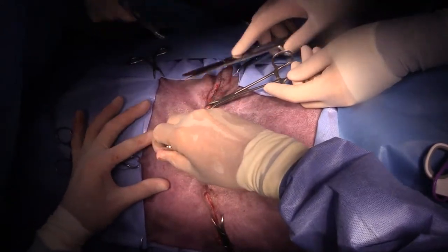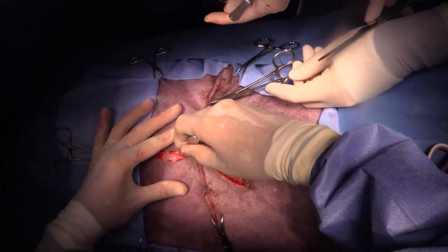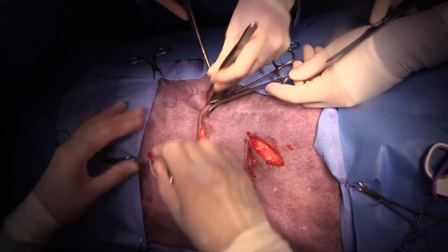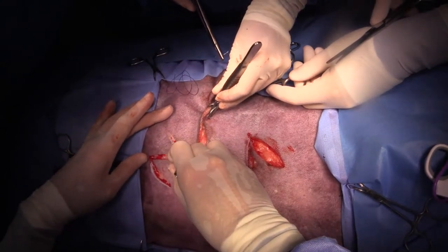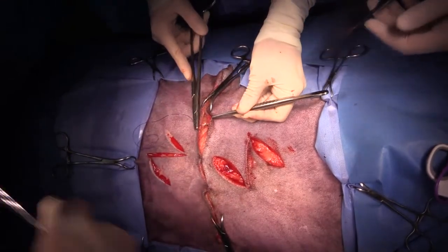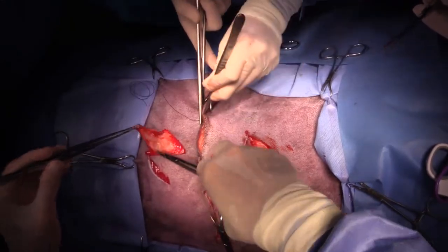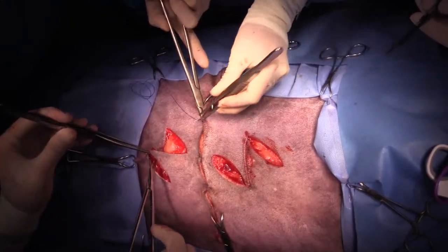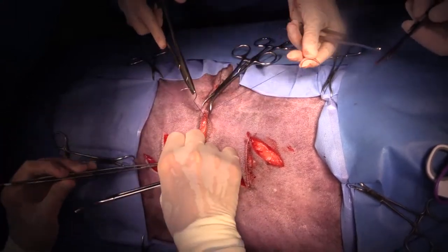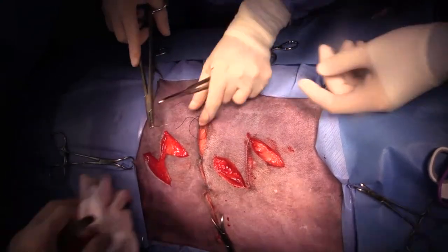So a horizontal portion of the Z perpendicular to the incision, parallel to the lines of tension. Then we make two limbs like this. Then just make sure that we release both limbs completely, like that, and like that. And then we'll pull one like that. And so that's our second little Z-plasty.